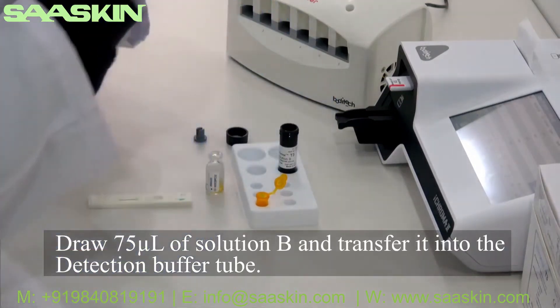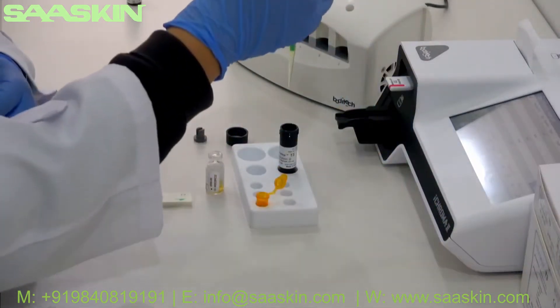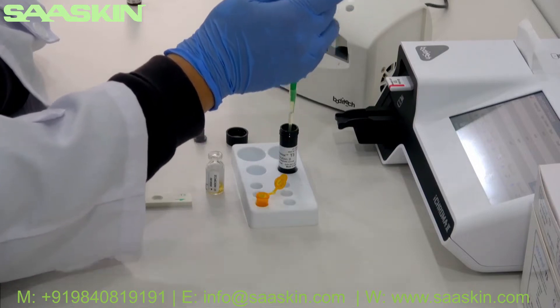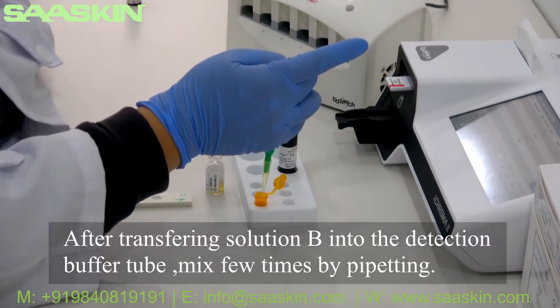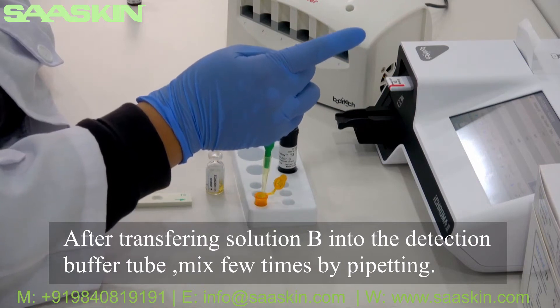Draw 75 microliters of solution B and transfer it into the detection buffer tube. After transferring solution B into the detection buffer tube, mix a few times by pipetting.